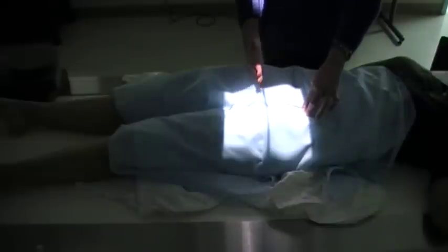So again, palpate ASIS. The pubic symphysis bone is going to be at the same level as the greater trochanter prominence. Draw your imaginary line and go down perpendicular from that to find your central ray area. Also for our AP hip, you want to roll the leg in 15 degrees. This rolls the greater trochanter out in profile, and the lesser trochanter is rolled so that you cannot see it or may see just the tip of it. This presents the neck of the femur best, which is an area that is often fractured.